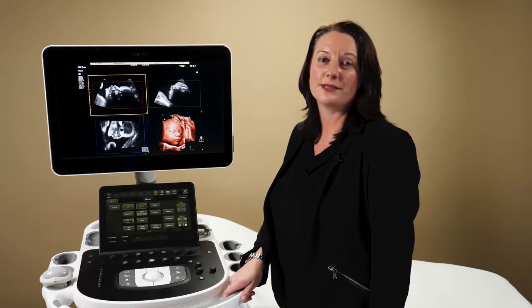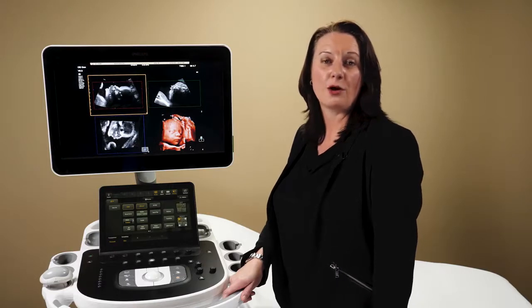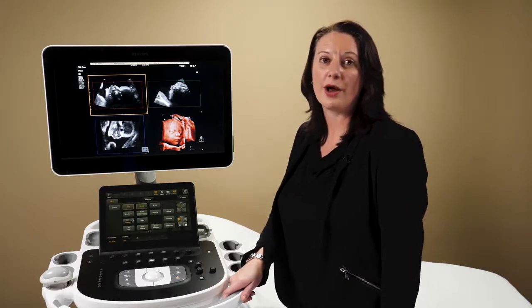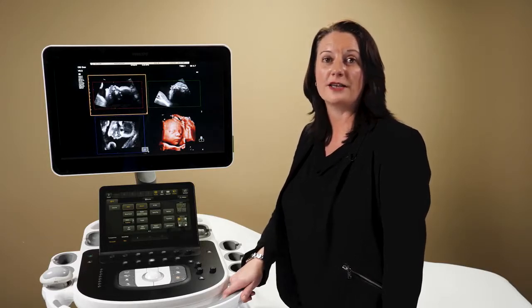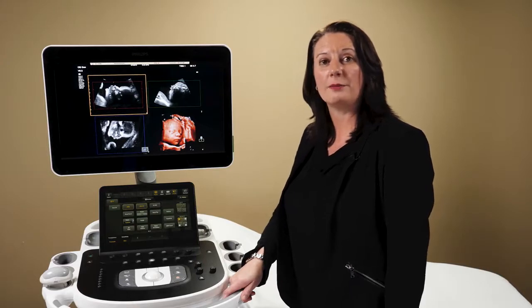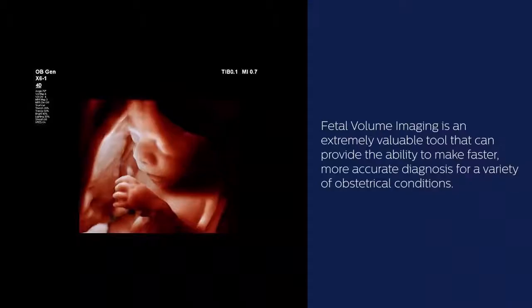In this video, you will see a demonstration on how to acquire a 3D or 4D obstetric dataset. After the video, you will be able to acquire and manipulate the volume dataset of a fetal face. These steps can also be used to acquire and manipulate the volume of any other fetal anatomy. Fetal volume imaging is an extremely valuable tool that can provide the ability to make faster, more accurate diagnosis for a variety of obstetrical conditions.